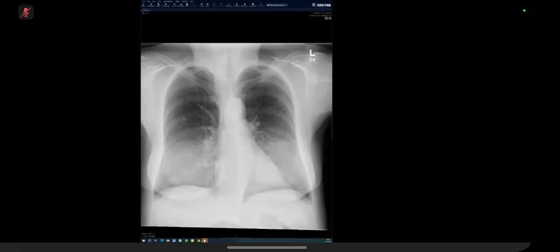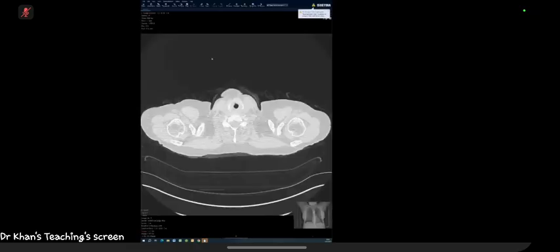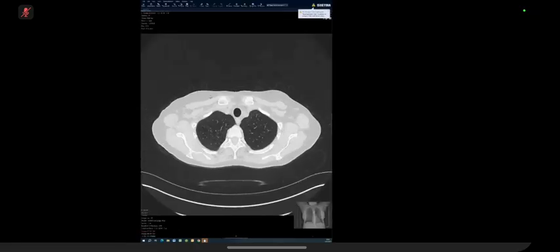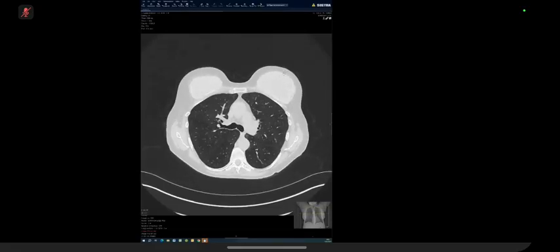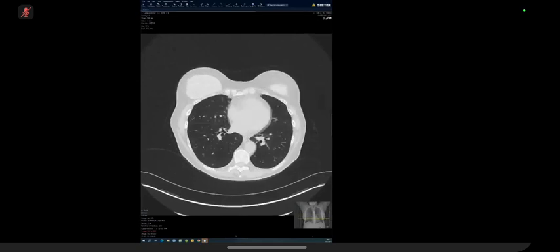So what do we want to do next? What I want to do next is alert the referring clinical team, refer them for a staging scan, so full CT chest, abdomen, pelvis, and refer to the lung MDT. Okay. So why did the first one get a chest only and this one's getting a staging? The first one, it looked like, that's a good point actually. I should have had.